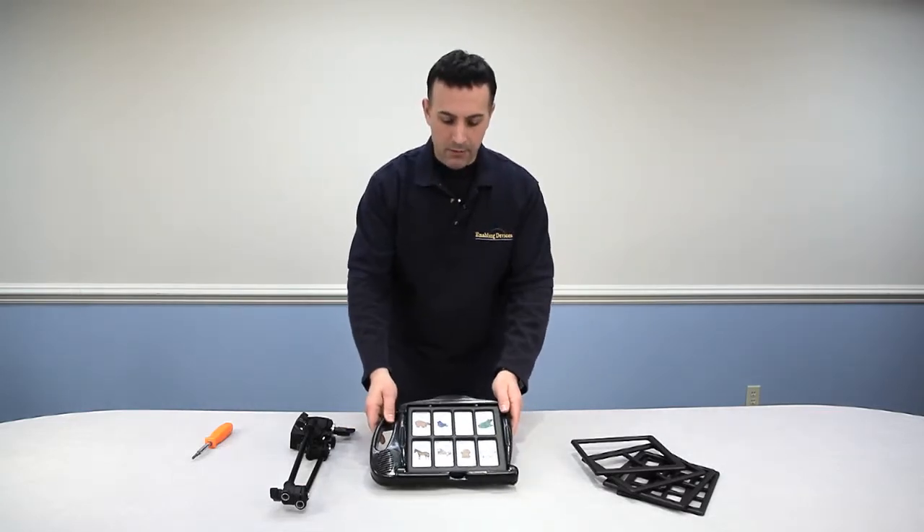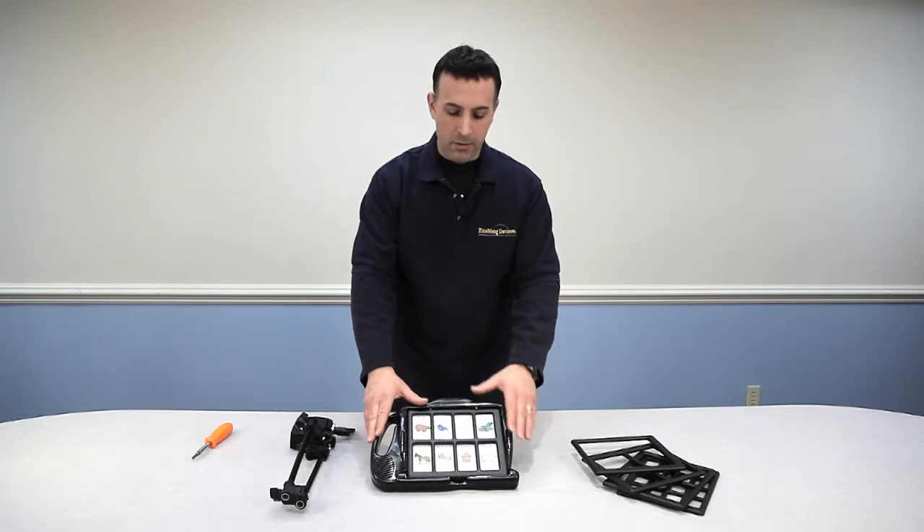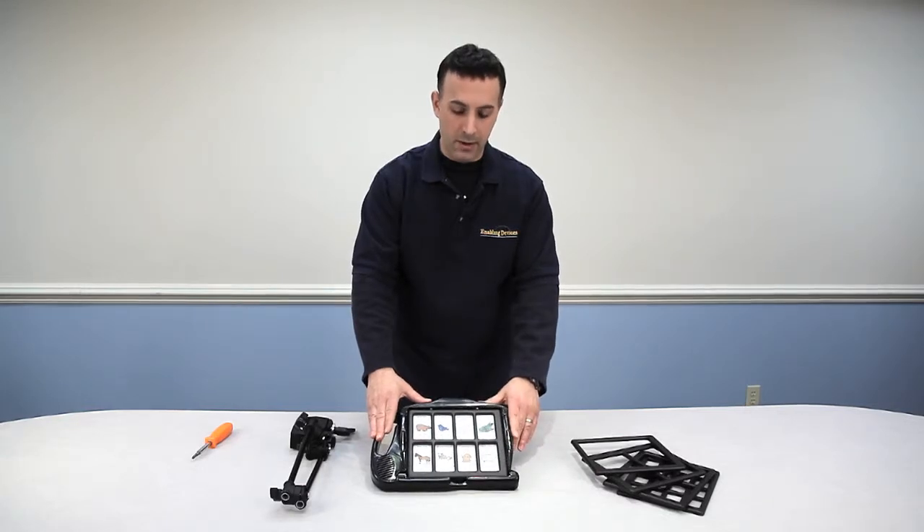This video segment is really going to focus on the mounting capability of the new 7-Level device. We're not going to really talk about the functionality of the device itself. There's another video on our website that goes in full detail on how to use the 7-Level.